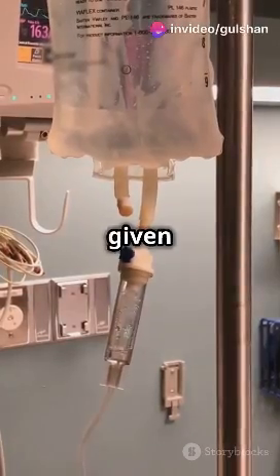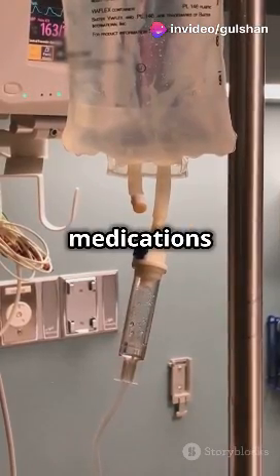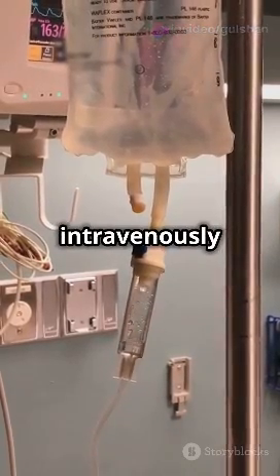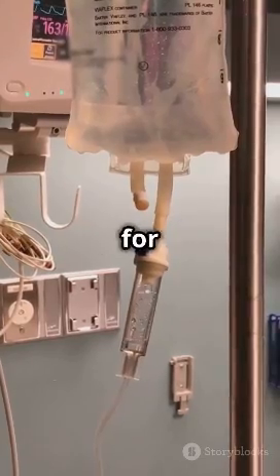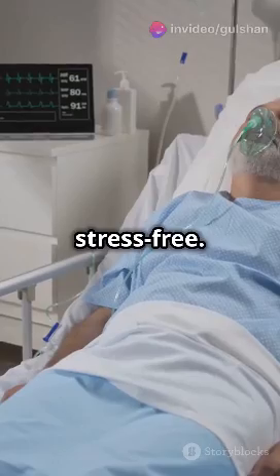The patient is given medication to make them comfortable and relax their muscles. These medications are typically administered intravenously and work quickly to prepare the patient for the next steps. This step is all about making the process smooth and stress-free.